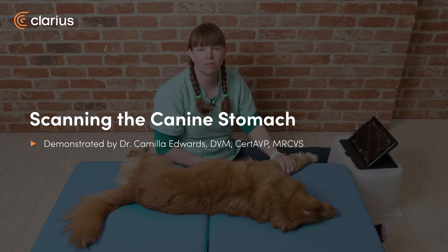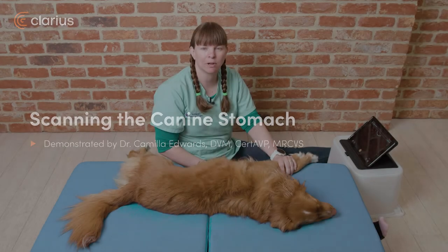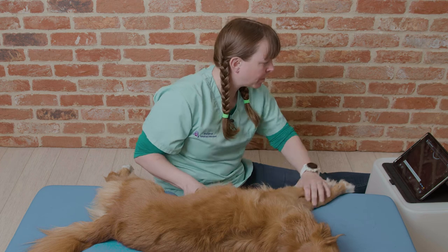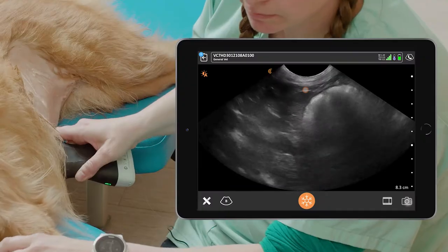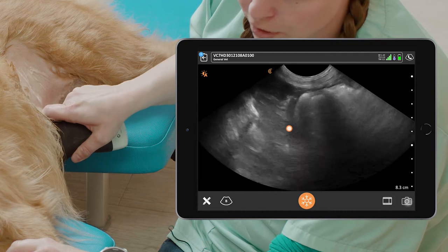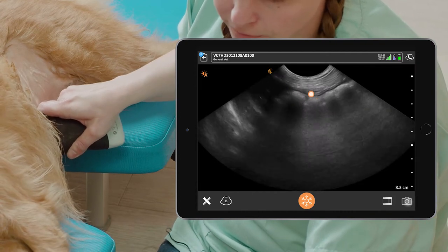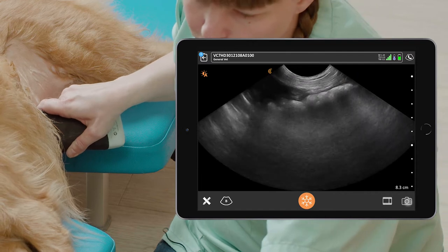Hi, I'm Dr. Camilla Edwards from First Opinion Veterinary Ultrasound, and today we'll be looking at how to scan the stomach of a dog. To scan the stomach of a dog, we need to place the probe just behind the xiphisternum where we'd see the liver, then move the probe up the costal arch until the stomach is central in our image. It's the first gas-filled structure we'll get to.